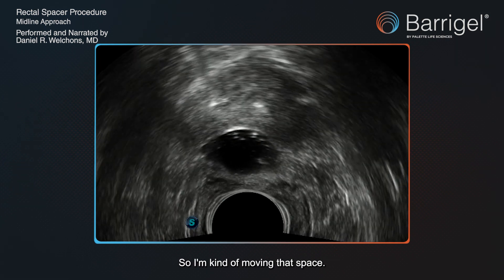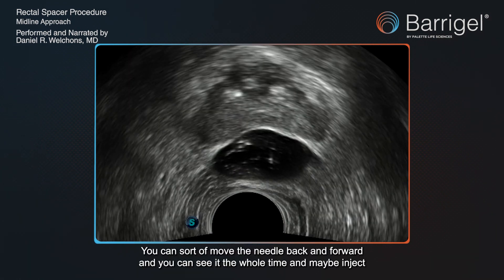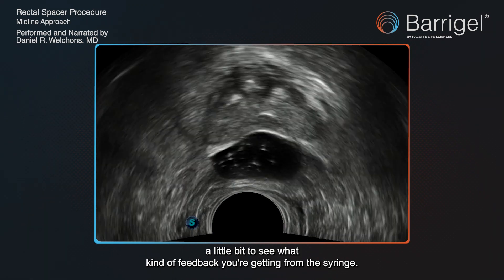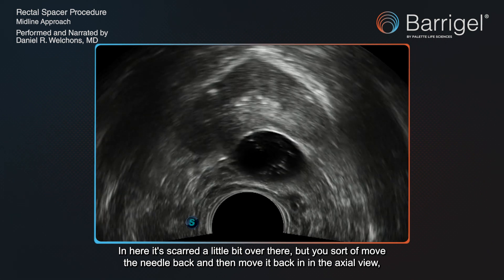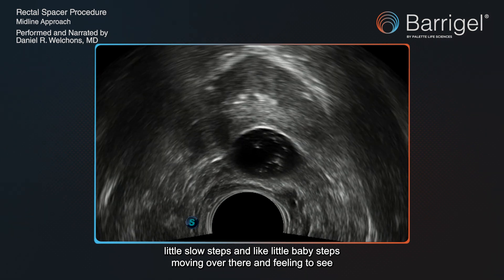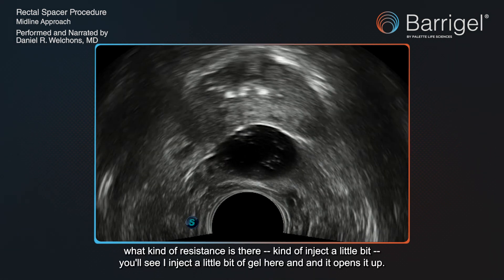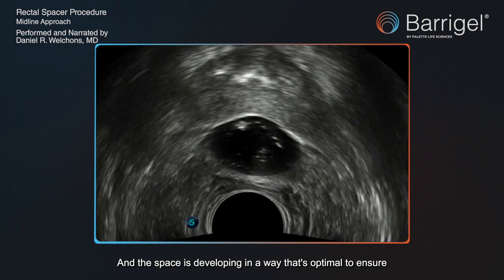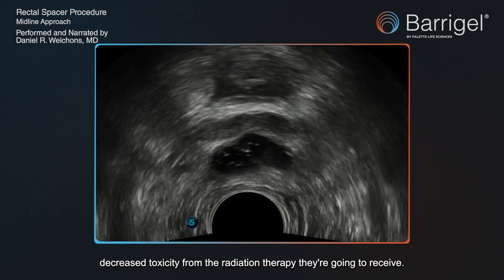Over here I want to add a little extra gel, so I'm moving into that space, feeling what the needle feels like, whether there's resistance. You can move the needle back and forward, see it the whole time, and maybe inject a little bit to see what kind of feedback you're getting from the syringe. It's a bit scarred over there, but you move the needle back and then back in — in the axial view — little baby steps, moving over there and feeling what kind of resistance there is, then inject a little bit. You can see it opening up more and more, and the space is developing in a way that's optimal to ensure decreased toxicity from the radiation therapy the patient will receive.